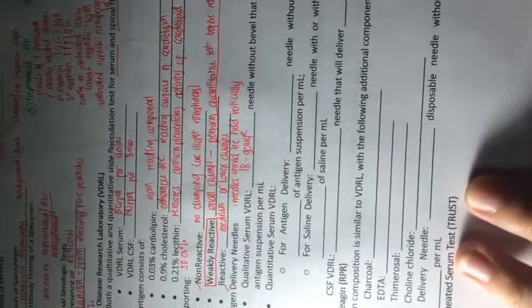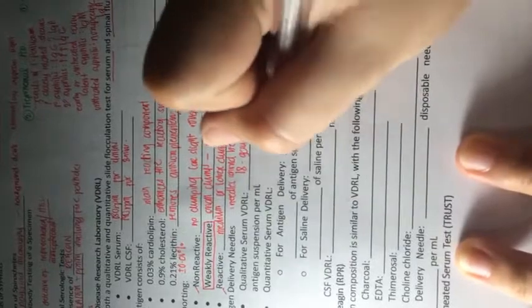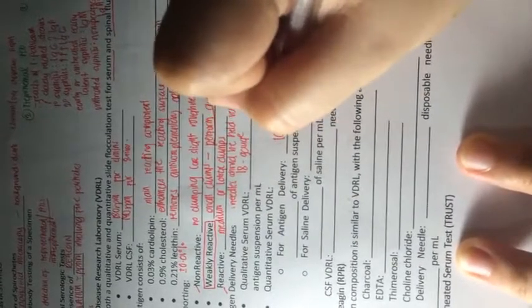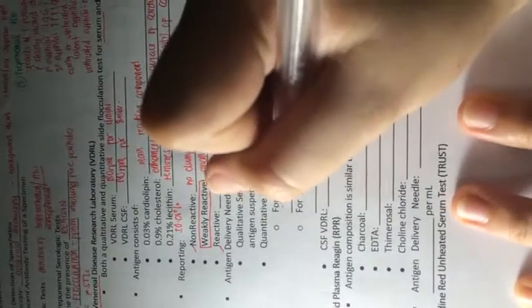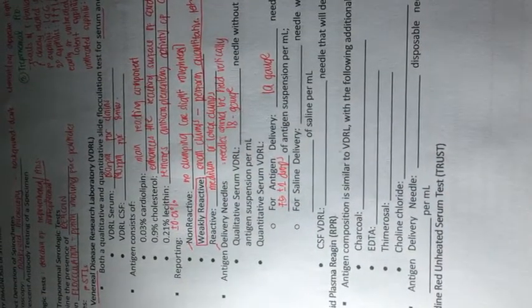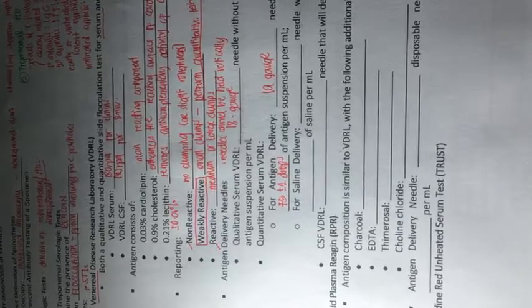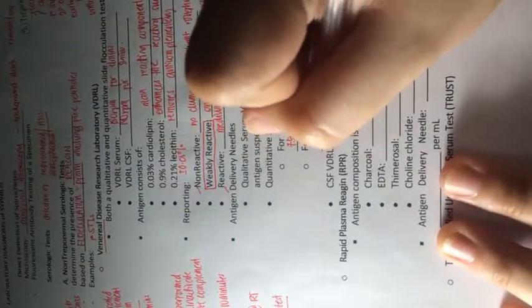Then for quantitative serum VDRL, for the antigen delivery, we should use a 19-gauge needle without bevel that will deliver 75 plus minus 2 drops of antigen suspension per ml. So that's for the antigen delivery. Then for saline delivery, we should use a 23-gauge needle with or without bevel that will deliver 100 plus minus 2 drops of saline per ml.